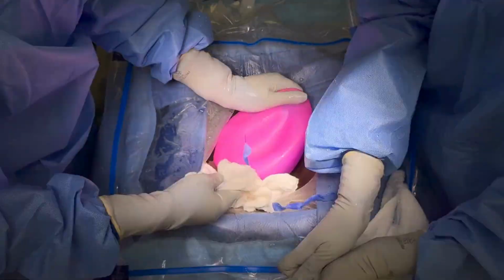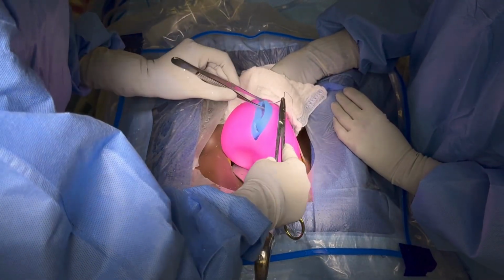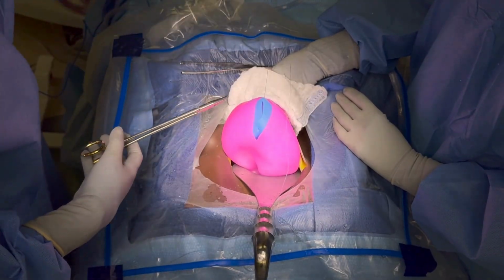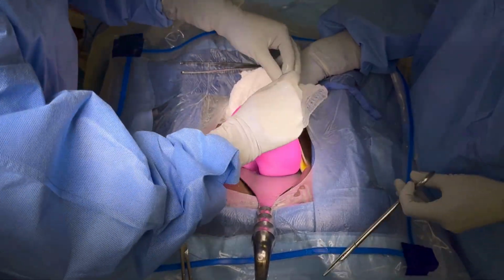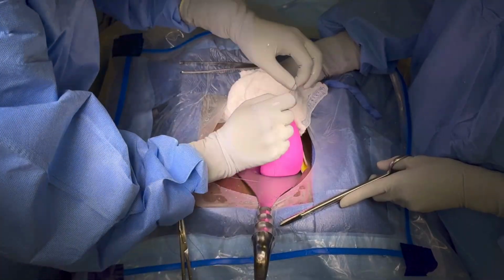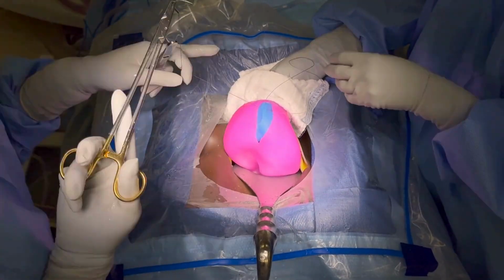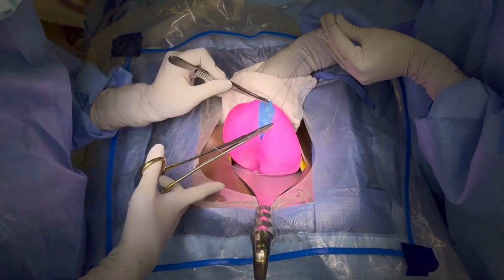The uterus is then exteriorized, cleaned with a lap sponge, and the bladder blade is reinserted prior to closure of the hysterotomy. In this model, the myometrium is closed using a single running layer of 0 Vicryl. However, in actuality, due to thickness of the myometrium, it is not uncommon for the myometrium to require a 2-layer closure, with a deeper layer followed by another more superficial layer.